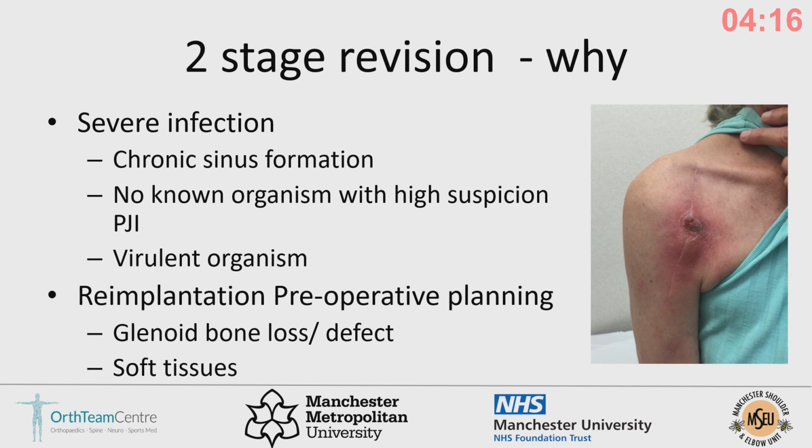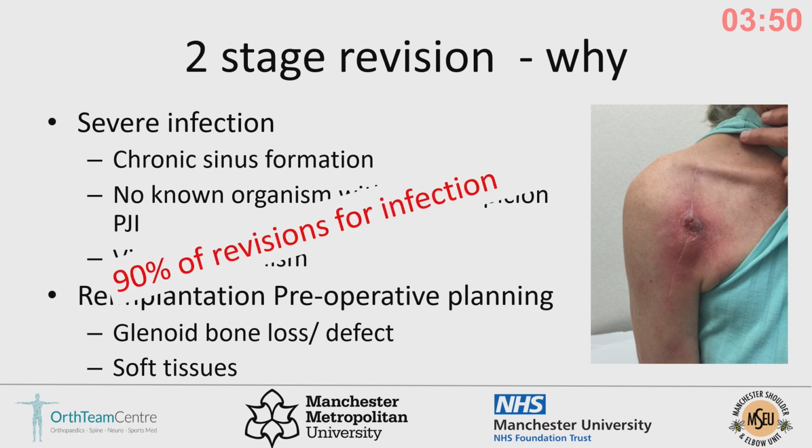But I also think that before learning about Ashish's new software, the reason why our shoulder replacements are doing so much better is that attention to detail for preoperative planning. And obviously it's a lot easier once you've got everything out and you've got time to sit down and plan things. And also to deal with all of the soft tissue contractures you can get with those patients with chronic infection. So in our hospital, in our unit, 90% of our revisions are 2-stage.